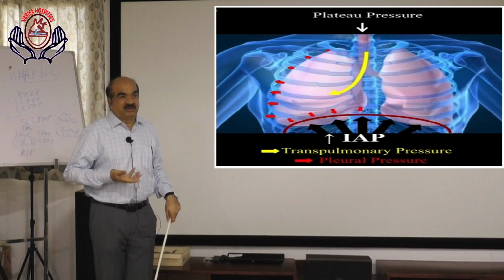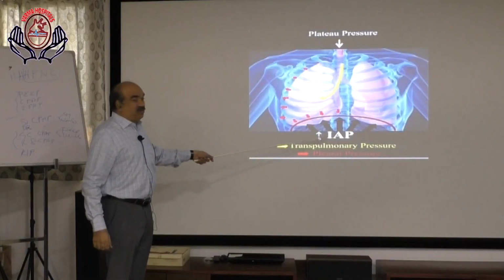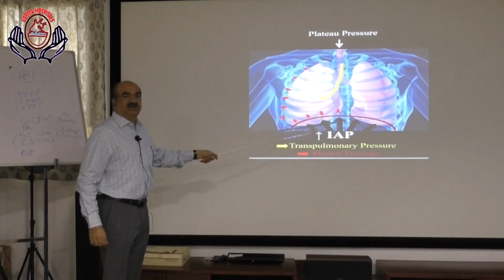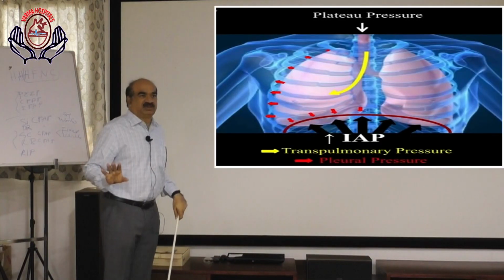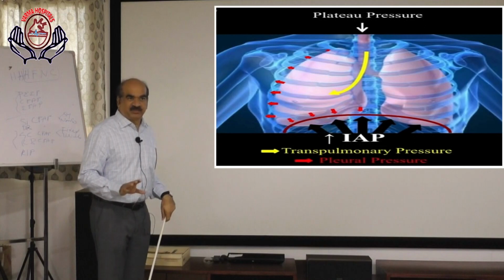We don't know whether the patient developed auto-PEEP, positive end-expiratory pressure. We don't know about static compliance, dynamic compliance. There are many factors which influence lung injury. Even abdominal factors, intra-abdominal pressure. High intra-abdominal pressure can influence transpulmonary pressure. Various factors are mainly important in the management. X-ray doesn't give any information except for making the diagnosis and for planning the management. That's the point for X-ray.